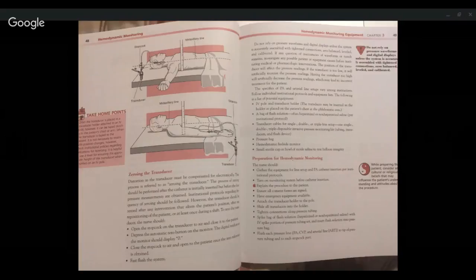Institutional protocols regarding frequency of zeroing should be followed. However, the transducer should be zeroed after any intervention that alters the patient's position, after any repositioning of the patient, or at least once during a shift.